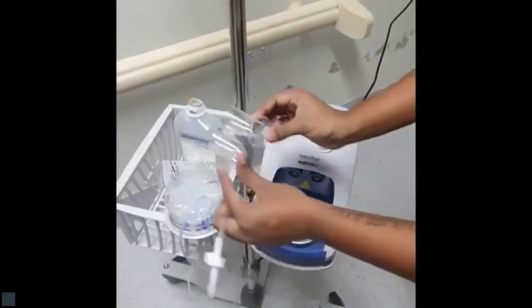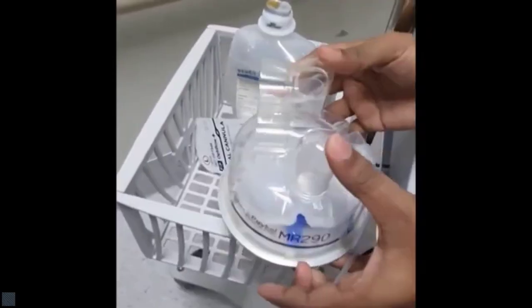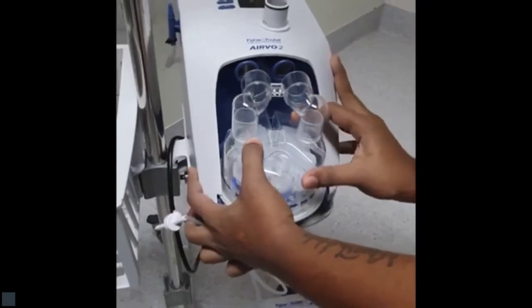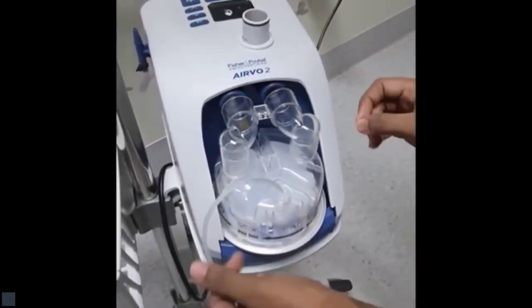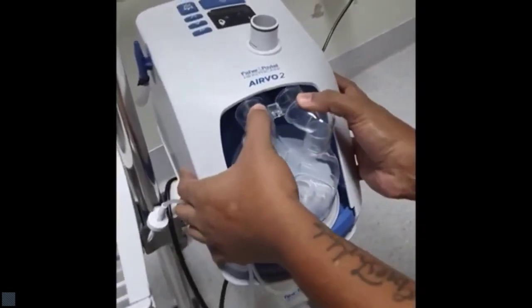So now we're going to align the ports on the water chamber with the ports on the adapter, and then pressing down firmly to connect both pieces together. Align the 2 ports on the chamber with the 2 ports on the machine. So we're pushing the water chamber into the machine, and it should make a click when it's firmly in place.